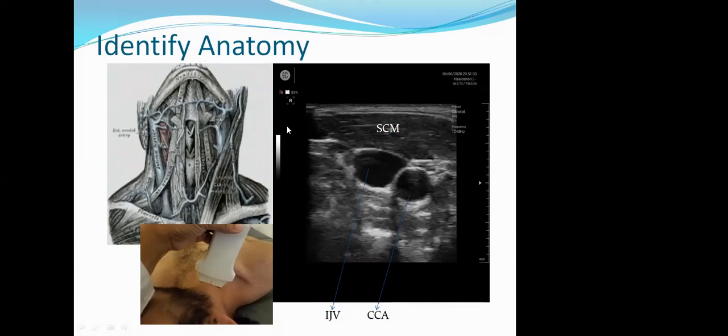Now, the very easy way to check the correct orientation is that you just tap on the footprint of the probe, and you will see a turbulence on the same side. So this will help you to be sure that, okay, your probe is in the right direction. Now, the direction is very important, because otherwise you will get a left and right confusion.